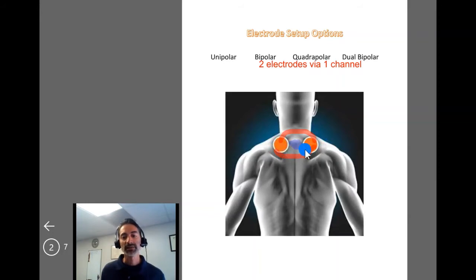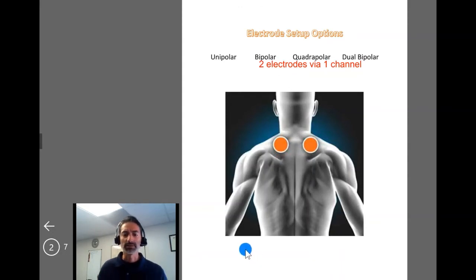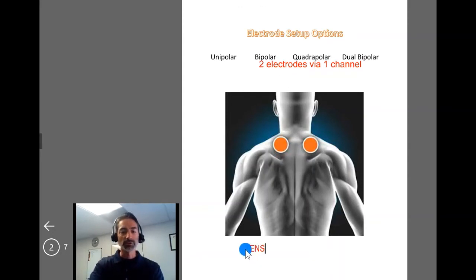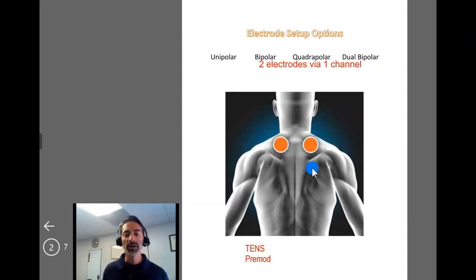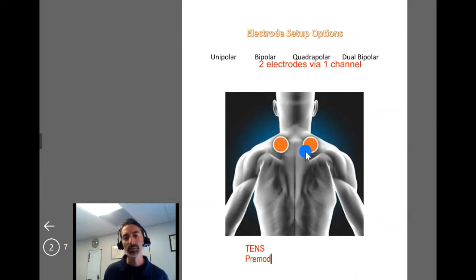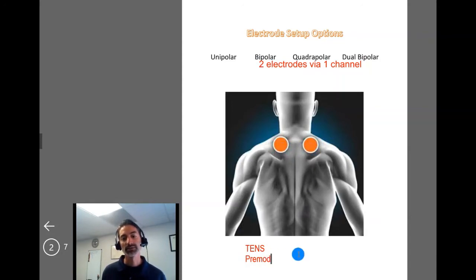A bipolar setup is typically associated with currents such as traditional TENS — high rate or low rate — and you could definitely do premodulated current with this setup as well. Traditionally, when talking about a bipolar setup, we're dealing with a small area that does well with an alternating current such as TENS or premod.